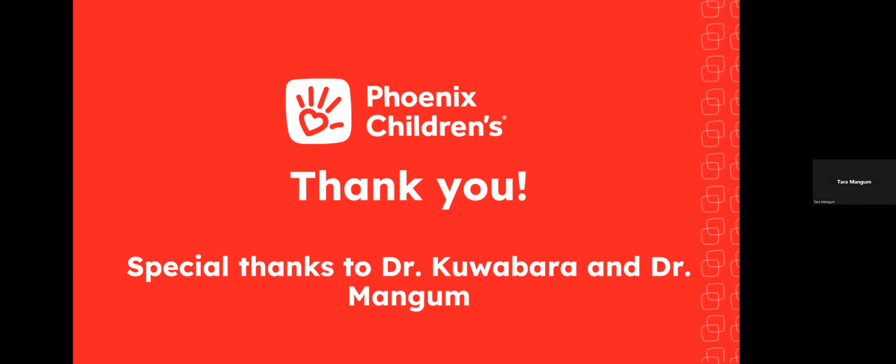That was very well done. Thank you. Just a quick question. Can any post-processing remove some of these artifacts, or once they're there, they're there? Usually once they're there, unless you fix it in the MRI suite itself, is what Dr. Kuwabara was telling me. Some of them you can use the aliasing effect, you can have anti-aliasing software that can take it out, but often you have to troubleshoot these problems while the image is being processed.